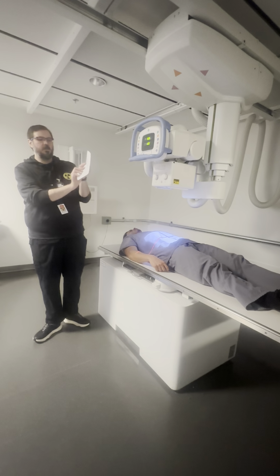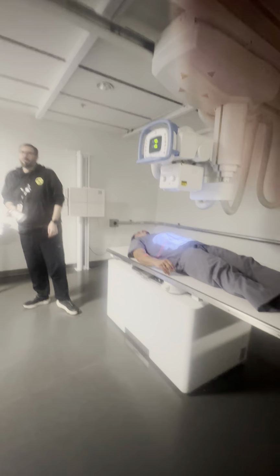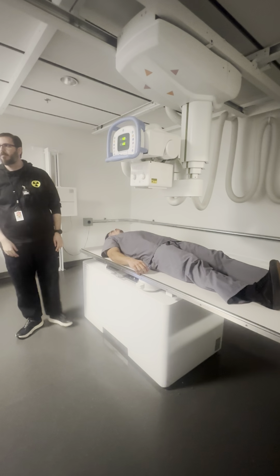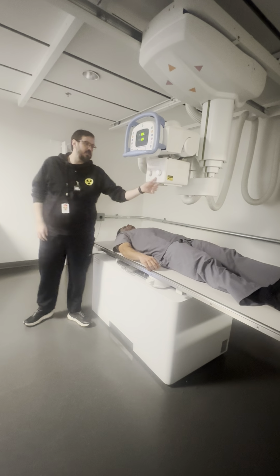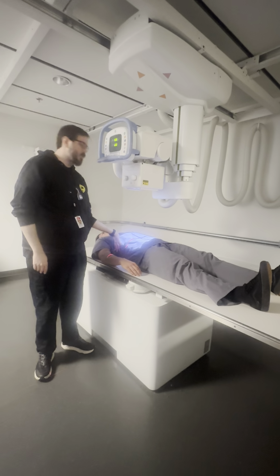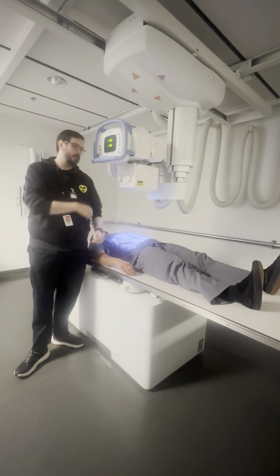And then it says here, initial at L2, delayed at the iliac crest. Initial what? Initial shot, initial drink. So you'll do a scout film first, and you'll do a high scout. So instead of just a scout KUB low, you go a little bit higher so that you can see the stomach, because that's where basically our exam starts, right? So I want to go to the level of L2. It's the exact same place we just shot, right? It's the exact same as the UGI. You get the stomach, you fit everything in there, right?